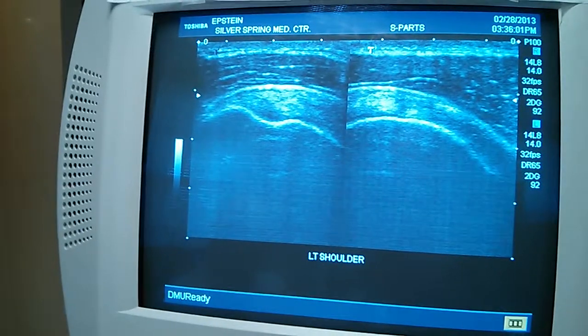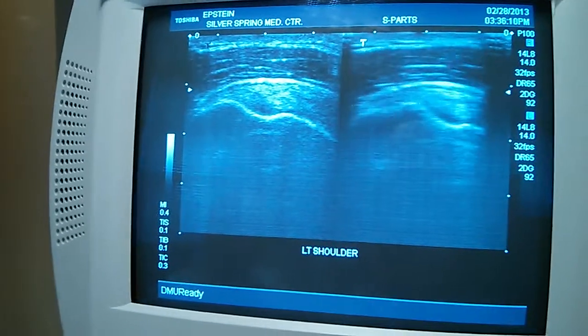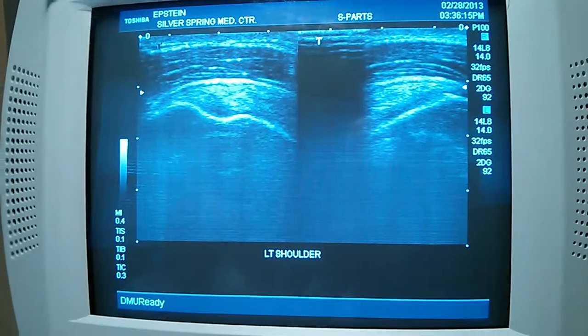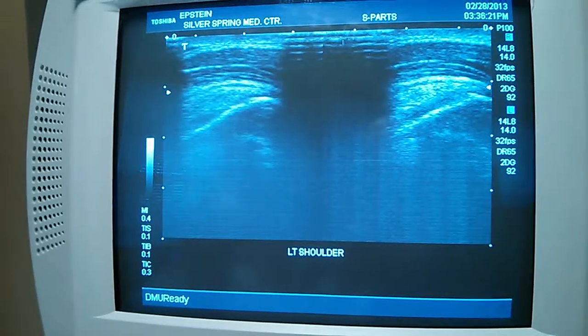So that muscle looks really good. And so far, what I'm pleased about is that you do not have a tear of either of these muscles. Because that would end my major league career. That would do it for you, pretty much. That'd be bad. No tearing. No tearing. So now I'm looking at the muscle in cross-section.